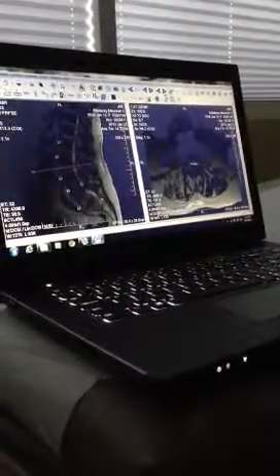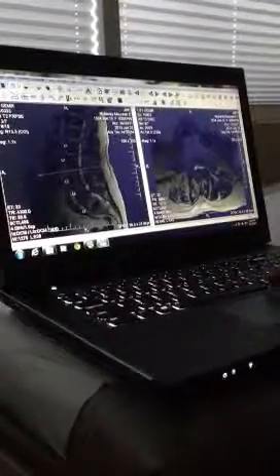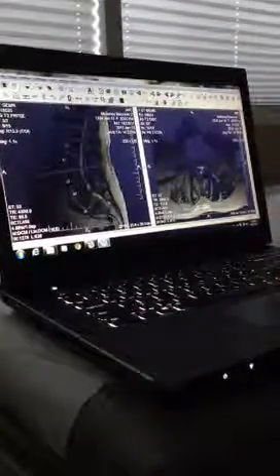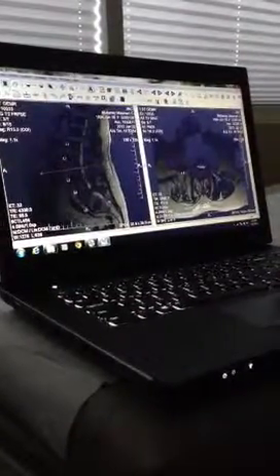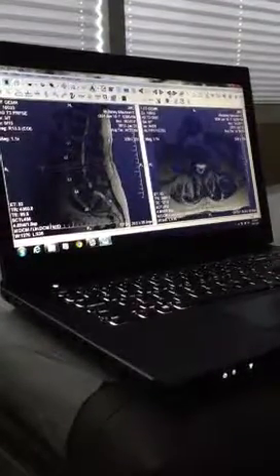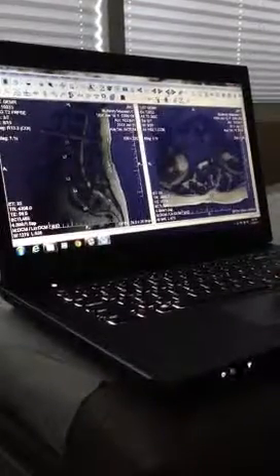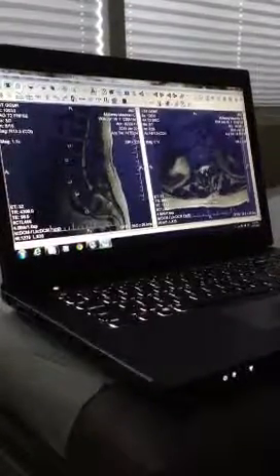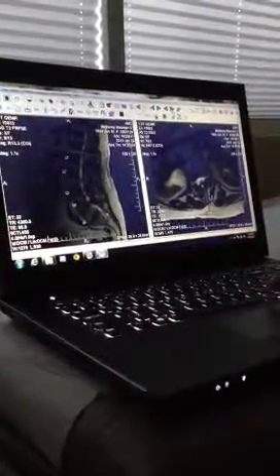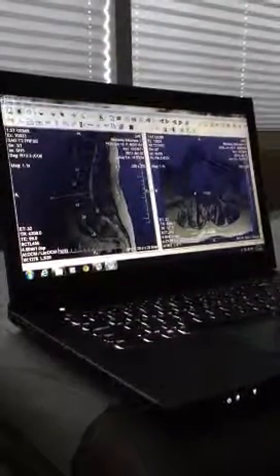What are we seeing here? Well, first thing that jumps out is the real narrowing that you have of this spinal canal. Remember we had that nice, big, almost diamond-like picture up here? Let me go back to show you on our control level. Remember this? Yep. We use this as our control. And now we're going to go down to L2-3. Where did that space go?